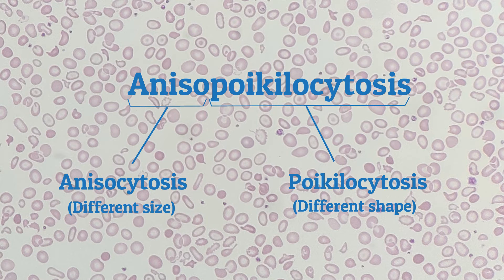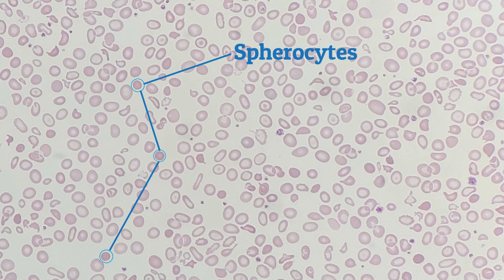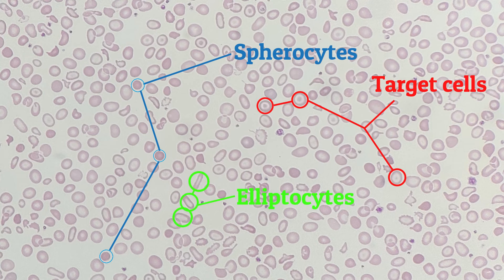Anisopoikilocytosis is therefore used to describe a blood film in which the red cells are of different sizes and different shapes. As you can see in the image, there are small cells such as spherocytes, as well as some large cells. There are target cells, elliptocytes and fragments, to name a few.